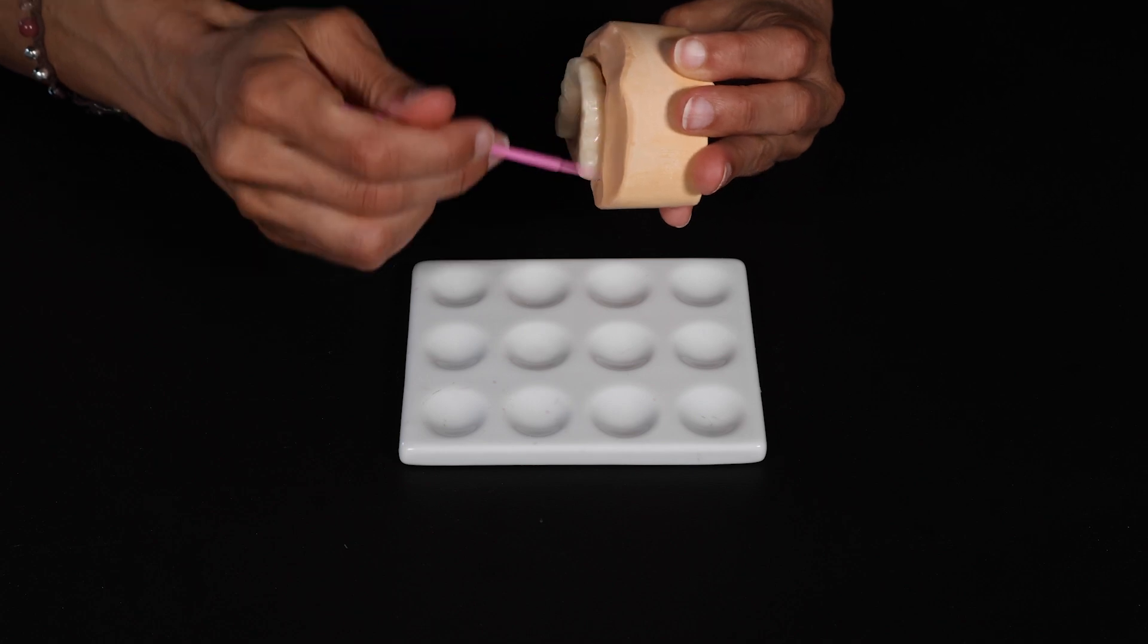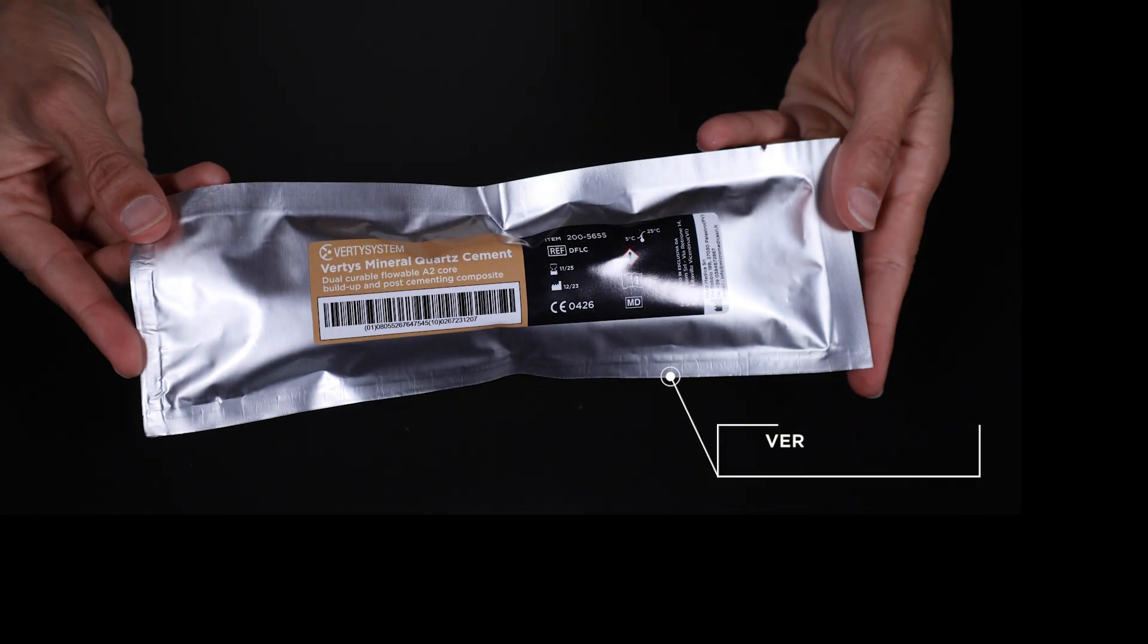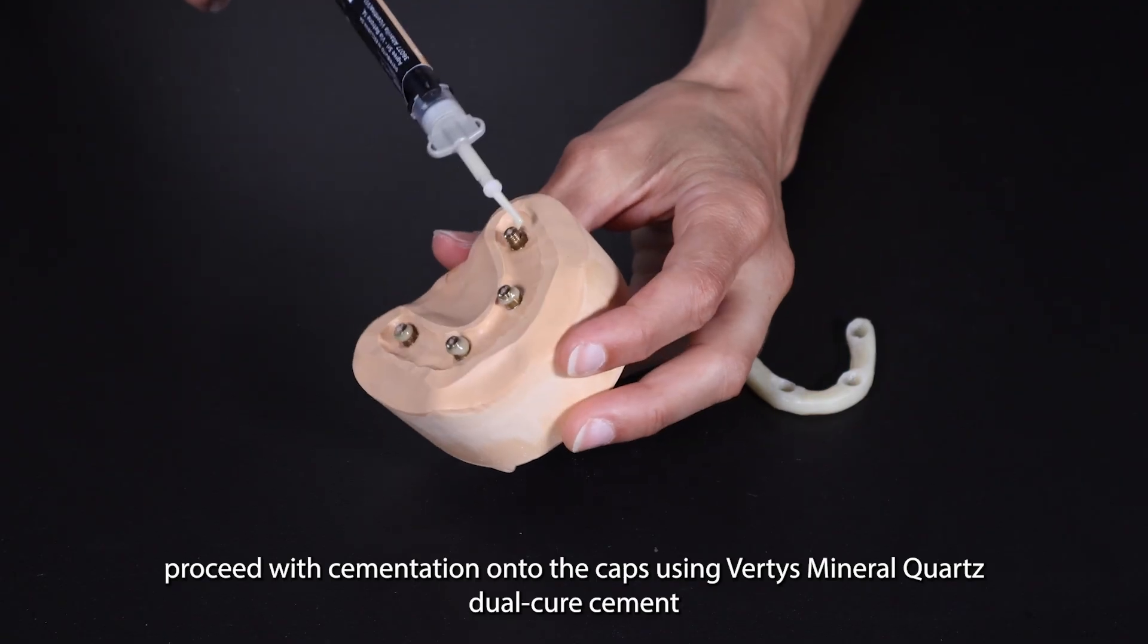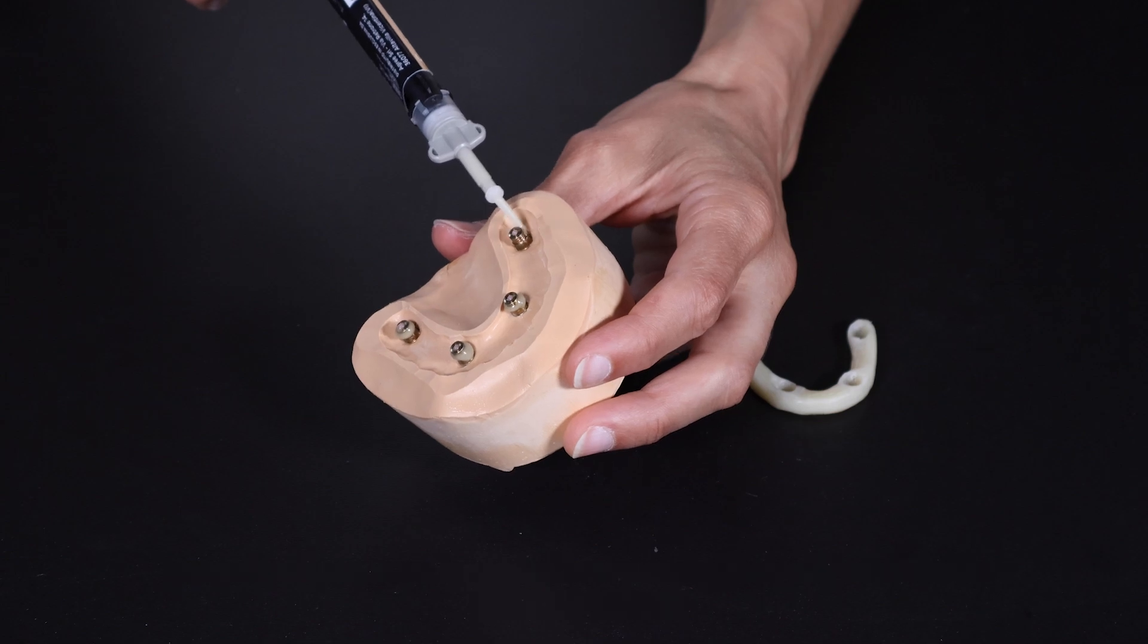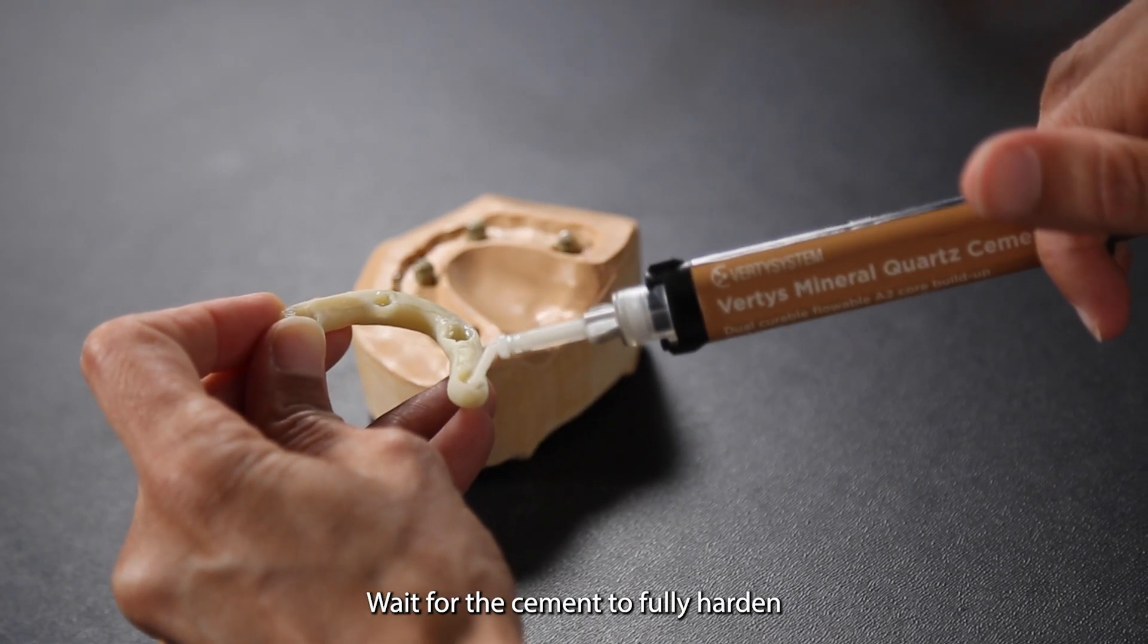Proceed with cementation onto the caps using Vertis Mineral Quartz dual cure cement. Wait for the cement to fully harden.